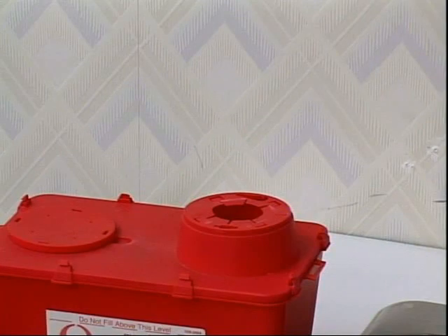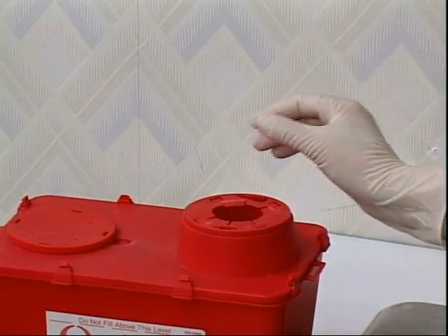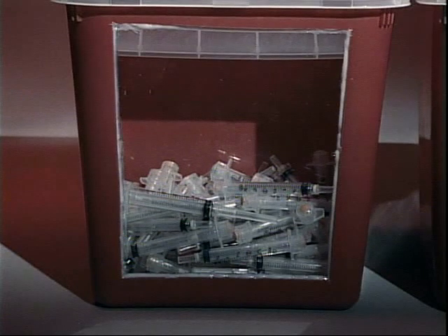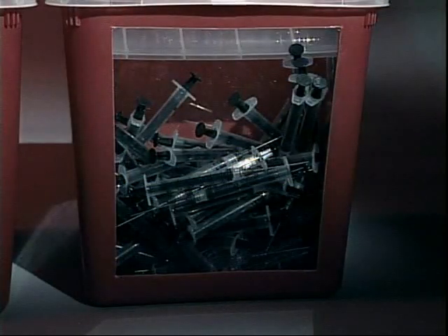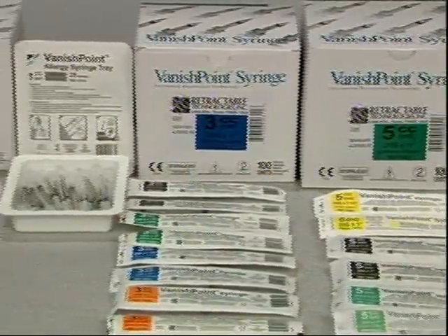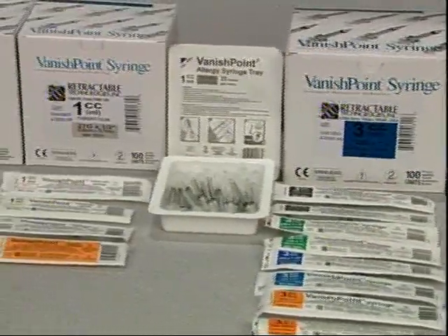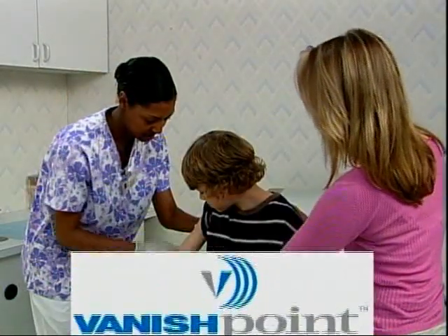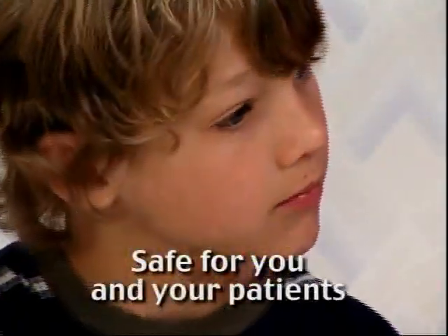Dispose of VanishPoint syringes in a sharps container in accordance with your facility's protocol. Activated VanishPoint syringes require less disposal space than most other syringes and eliminate disposal-related injuries. The complete line of VanishPoint syringes allows you to safely give intradermal, subcutaneous, or intramuscular injections. VanishPoint — safe for you and your patients.